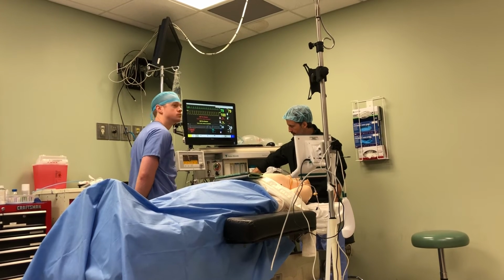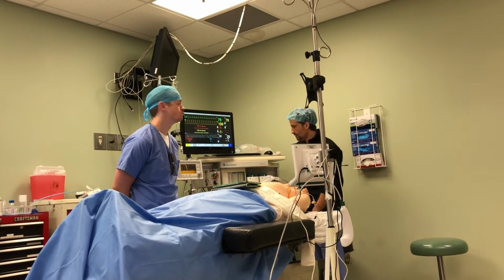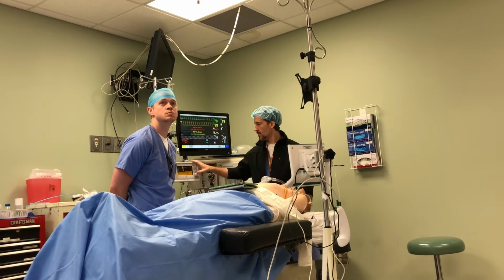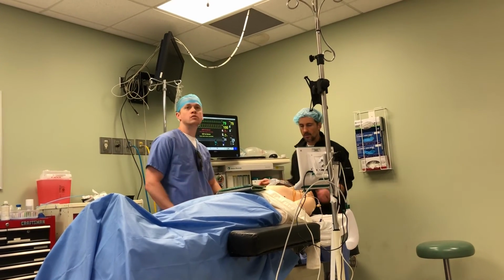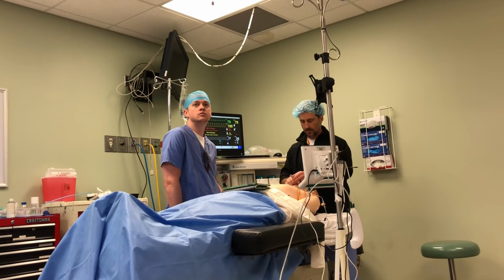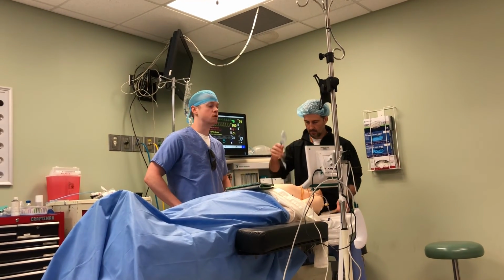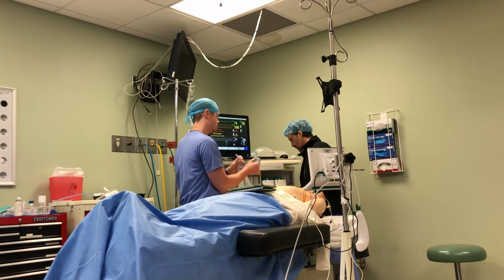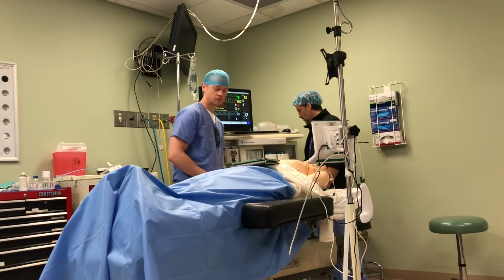What is PSV Pro? It's pressure support. Yeah. Coming from somebody who didn't have PSV Pro in that training, PSV Pro was introduced as the first ventilation mode for the LMA. Otherwise, before that, it was your hand. There was no ventilation mode approved for LMA use. PSV Pro is pressure support that allows you to turn them on a vent.